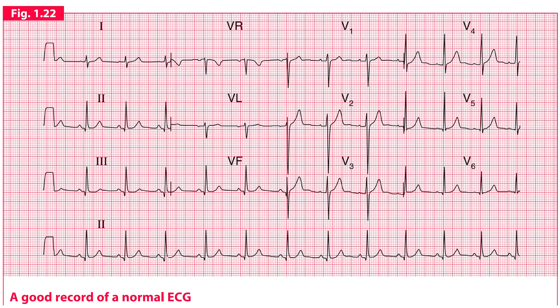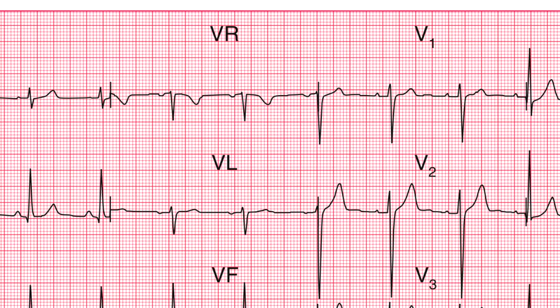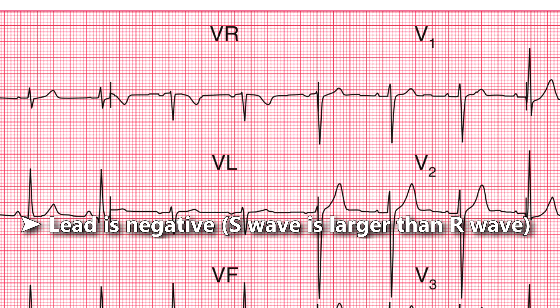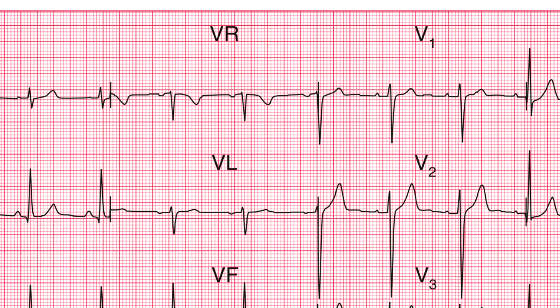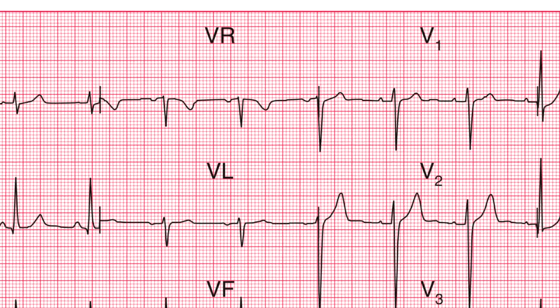Focus on lead VR. Notice that it is negative, which means its downward deflection is greater — in other words, the S wave is greater than the R wave. Also note that P and T waves are inverted in this lead. These are all the normal features of this lead.